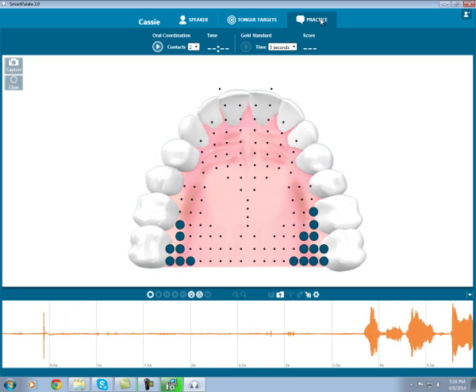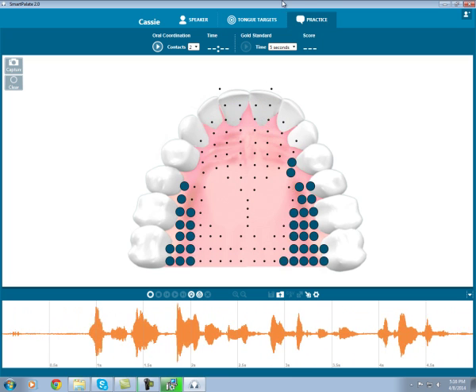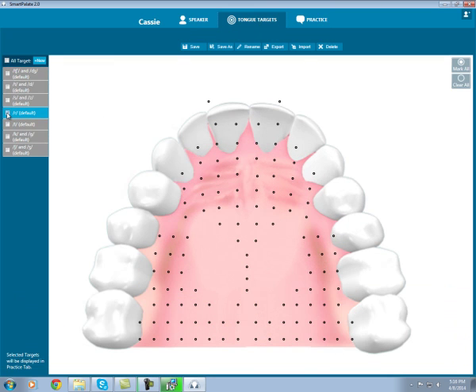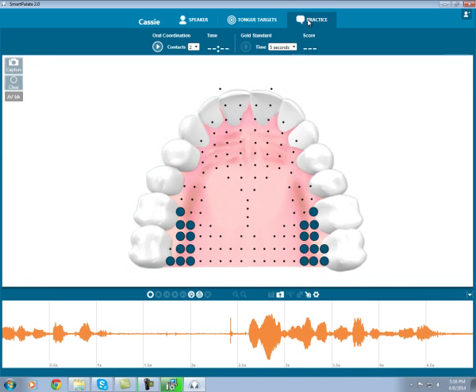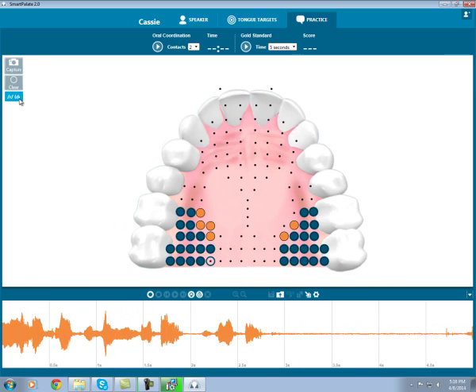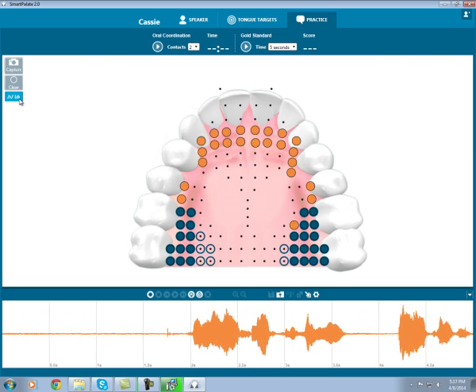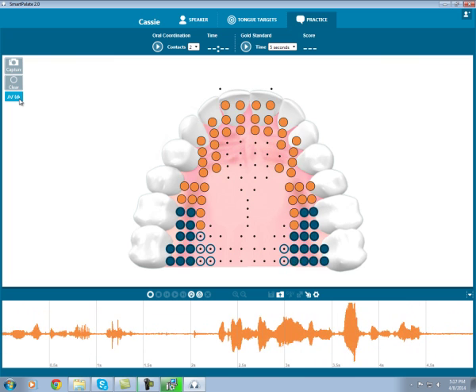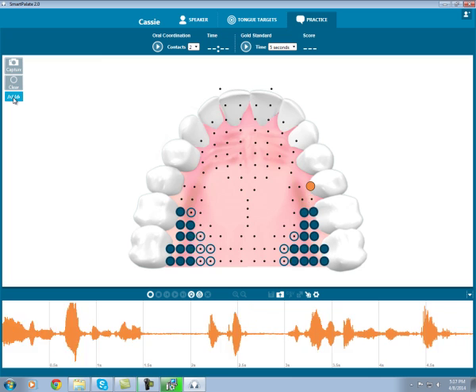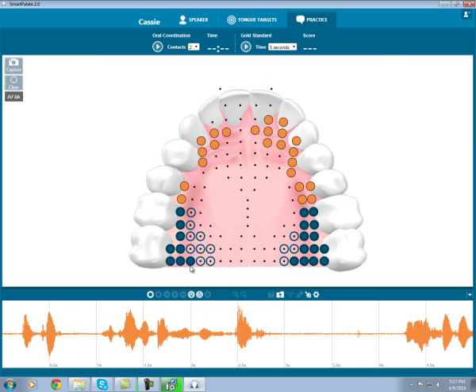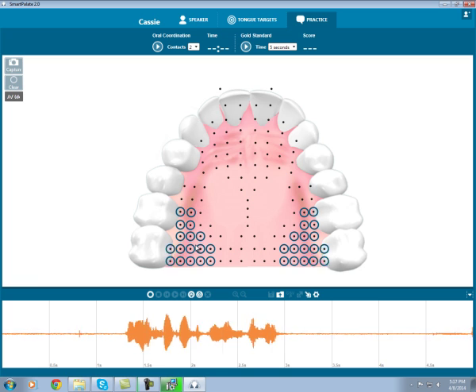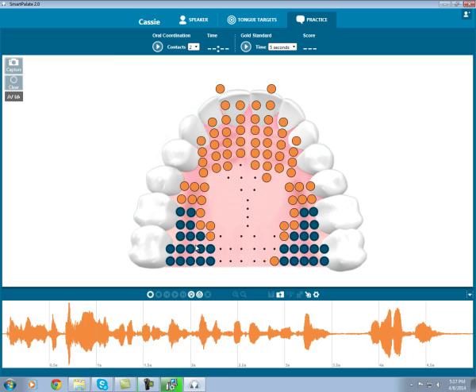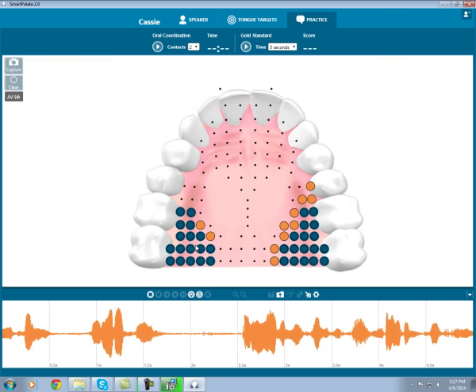Let's start by looking at the most basic feature, the tongue targets. I'll start by quickly pulling over a default target. We'll go into more detail about this later on. For now, I'll select the general R target to use in the practice tab. You can see now that in the practice tab, I've clicked the target button I just added. Blue circles appear on the palette. And when I hit the area indicated by the target circles with my tongue, they light up blue. Anywhere that my tongue hits outside of the target area lights up orange.